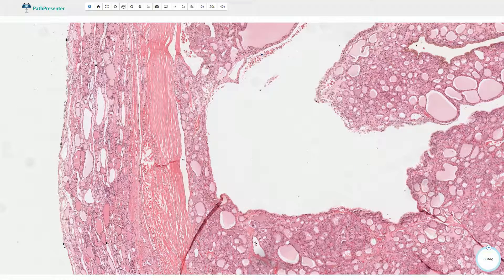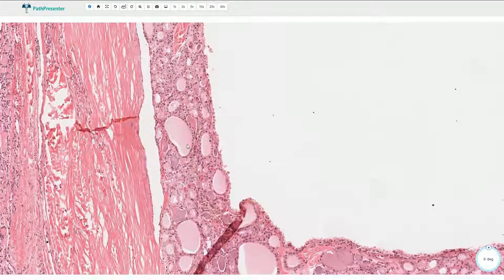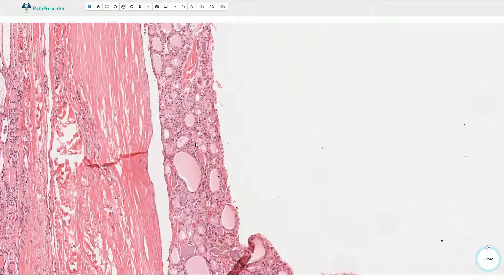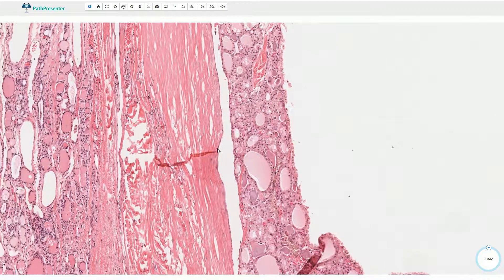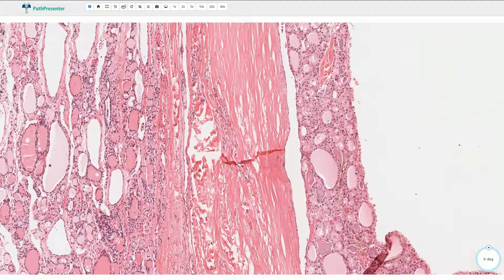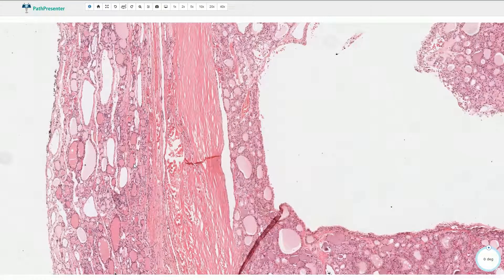This is the follicular adenoma, which is partially cystically transformed. The follicles are lined by cuboidal thyrocytes, and some of these follicles are relatively small. Here we have the fibrous capsule, and if we compare this parenchyma to the adjacent thyroid parenchyma, it looks different — here we have relatively flat thyrocytes and the cells are less prominent. This different appearance is usually slightly more prominent than in this case.